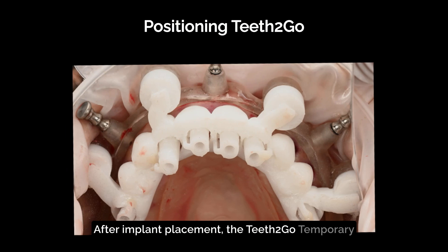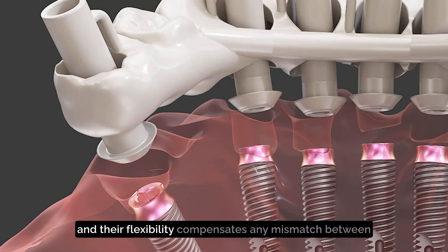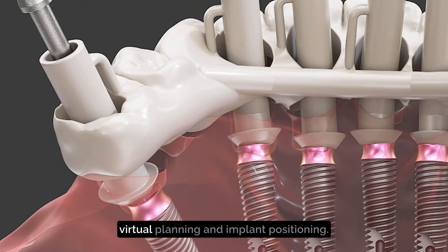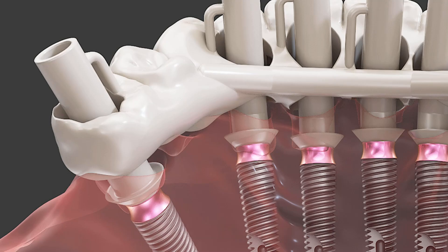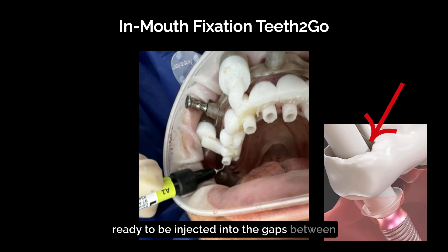After implant placement, the Teeth to Go temporary restoration is precisely positioned on the guide plate. Prosthetic screws are screwed into the cylinders, and their flexibility compensates for any mismatch between virtual planning and implant positioning. At this stage, light-curing flow composite is ready to be injected into the gaps between the cylinders and the prosthetic restoration.